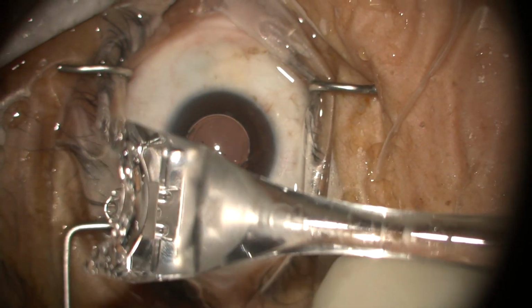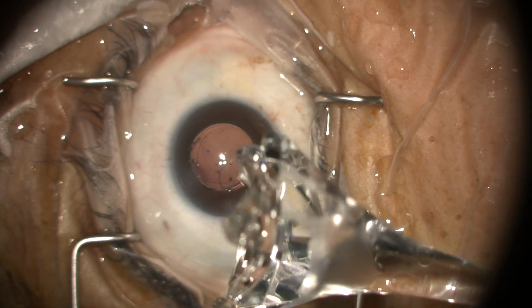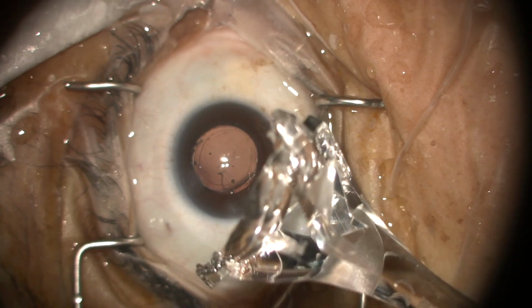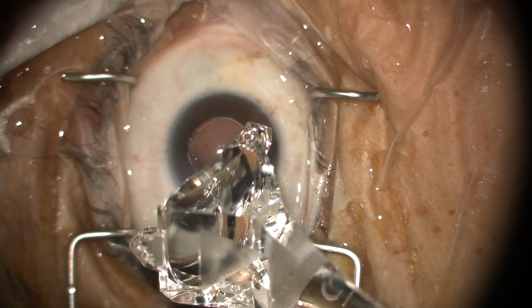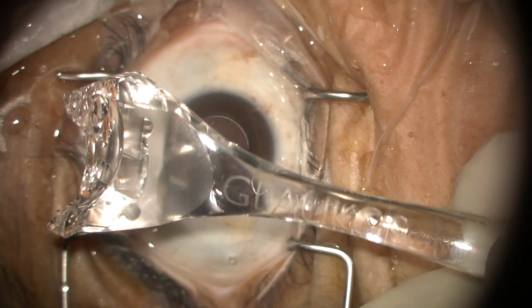This is the iPrism SX, which provides a wide field of view and very clear optics and eye stabilization features. You see it has sort of a tripod approach and those little tripods can actually latch onto the eye to give you some mobility, and you can move the eye sort of dynamically.